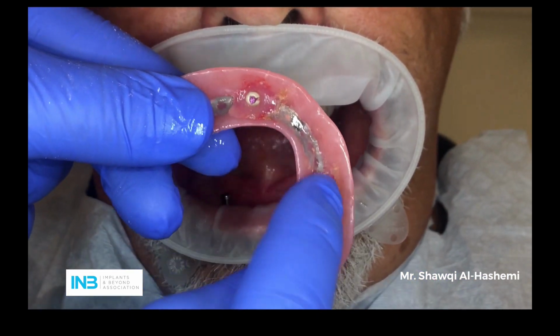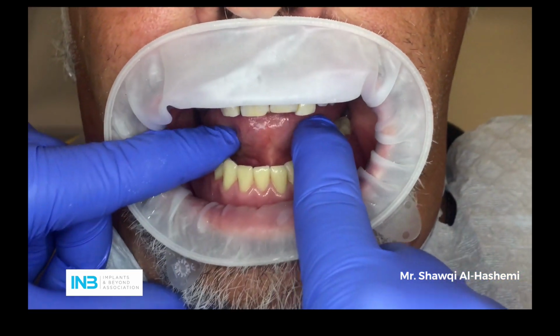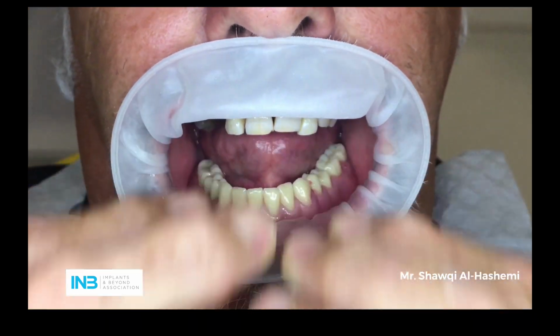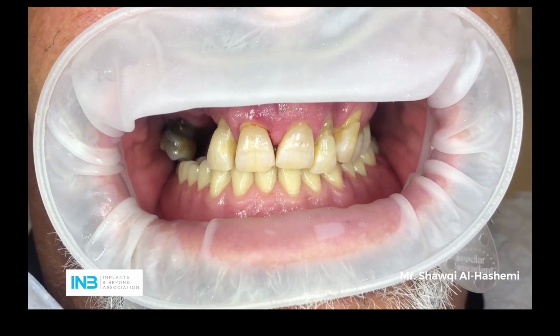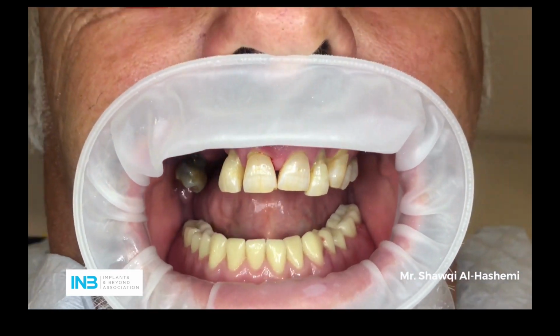Now, as you can see, we have polished the housing, and now we're going to place it back. Steve, can you click it for us, please, with your hands? That's it. Good. All right, and bite together. Excellent. Now, before we do anything, bite, open, and close. Bite, and open and close. Yeah, good. Can you take it out for us now?